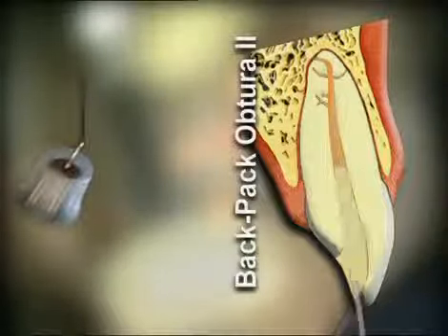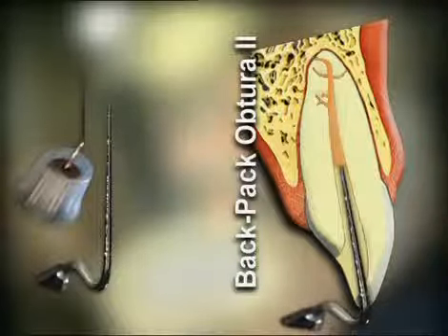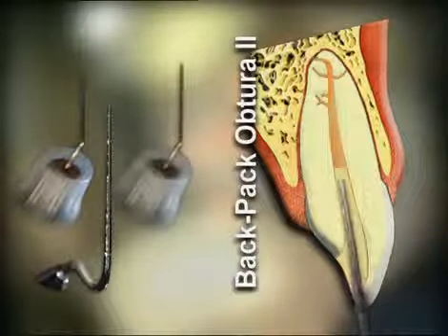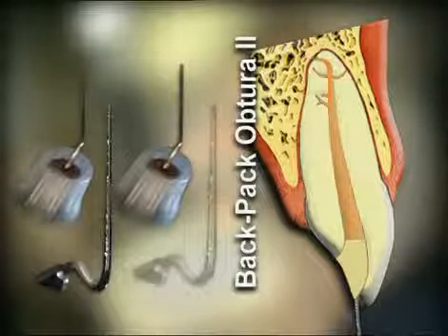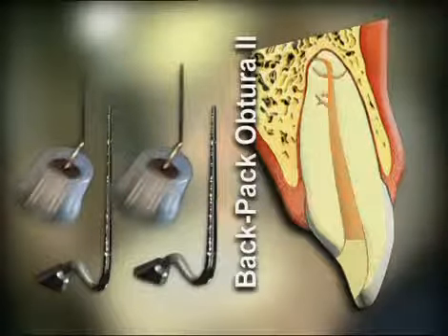Through a series of gutta-percha injections and vertical compactions, the canal is filled completely step by step. The hot tip of the needle will resoften the most coronal aspect of the apical core of gutta-percha, ensuring cohesion and homogeneity during backpacking procedures.